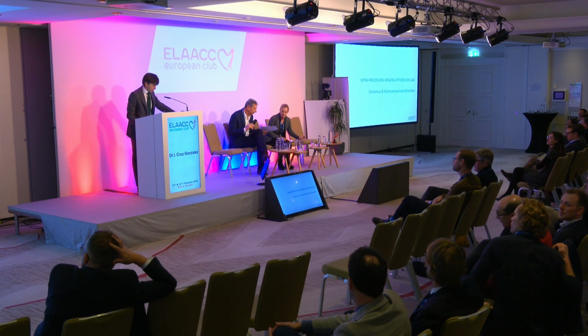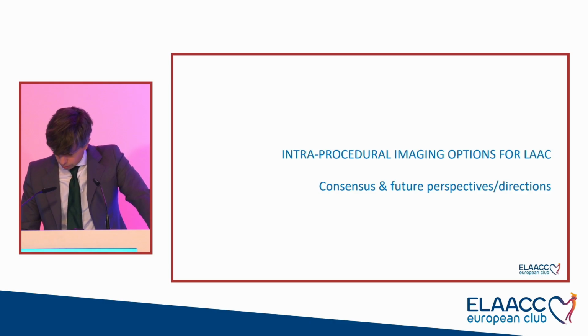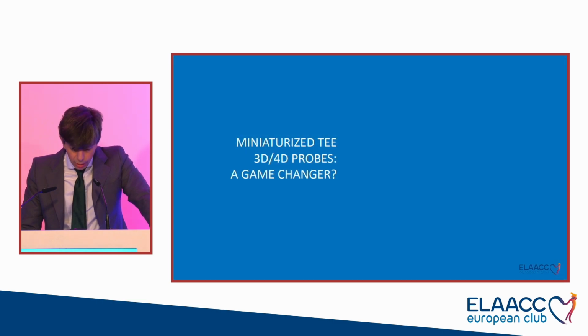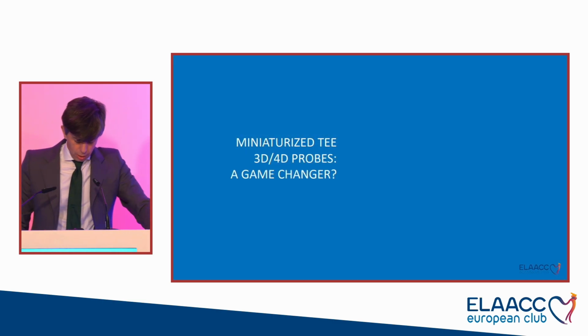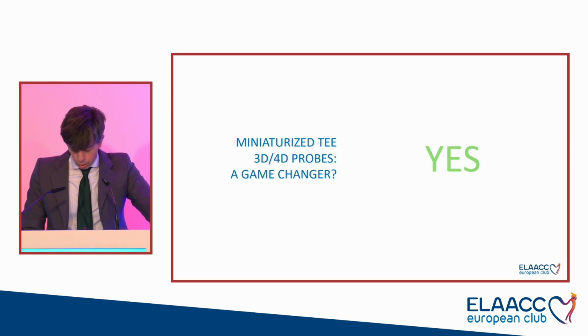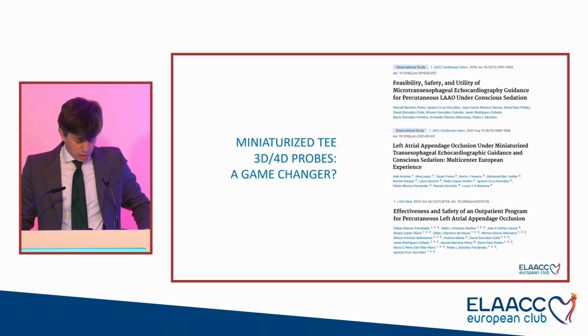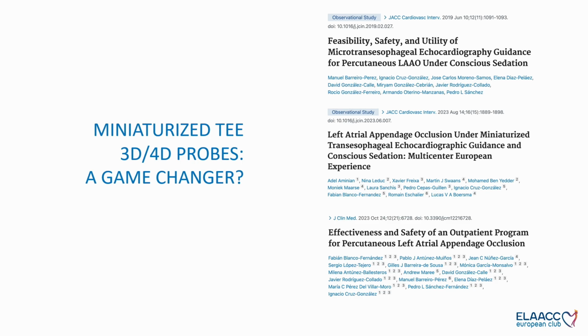Thank you, Sergio. We are late again, so I will make a quick summary of what we have discussed during this session. Laura has presented the 3D and 4D probes as a game changer, and I really think we should agree that it can be a game changer. I'm totally biased because I have been using the micro TEE probe for the last 6 years now. We describe our initial experience, we participate in an adult multi-center European experience, and we have published that this is not just a problem of procedural imaging. It's a problem that we changed our strategy.